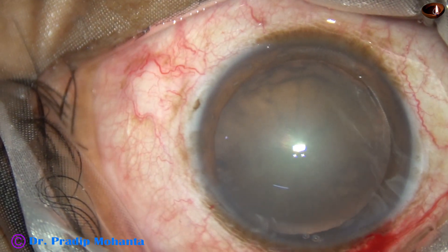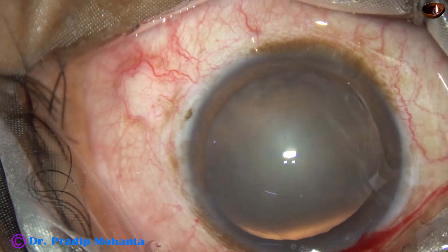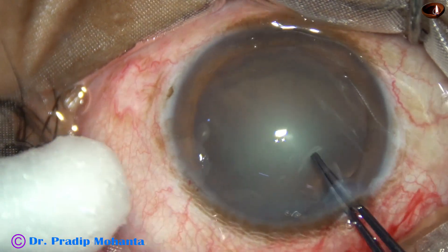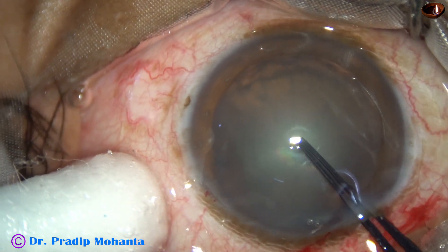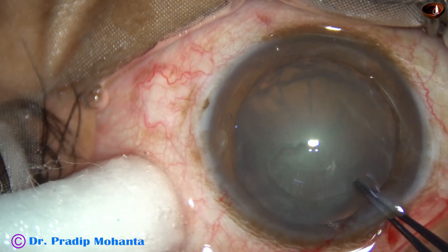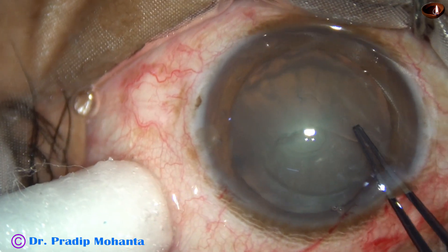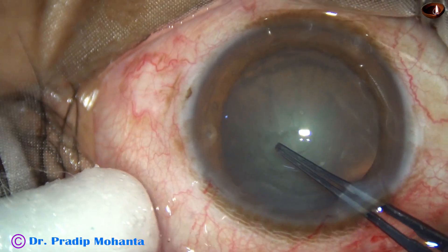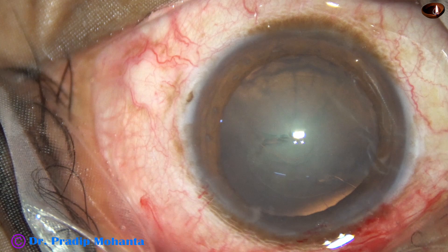Capsulorhexis is being done with the help of utrata forceps. When we do rhexis with utrata forceps, the anterior lip of the main wound is kept lifted up. A capsular tag is raised, and this capsular tag is guided anti-clockwise all around to do a rhexis of adequate size.